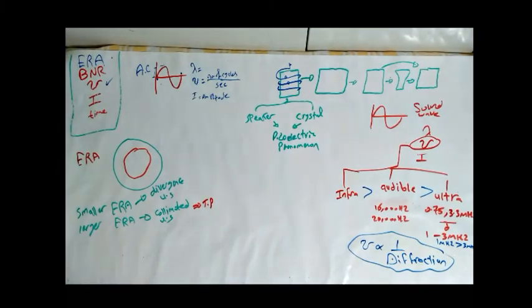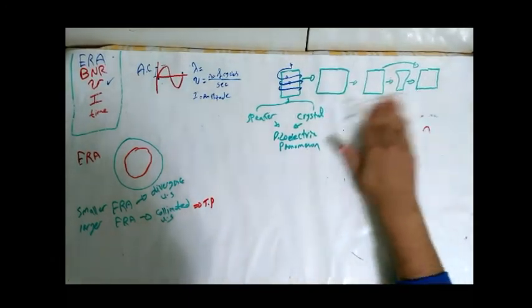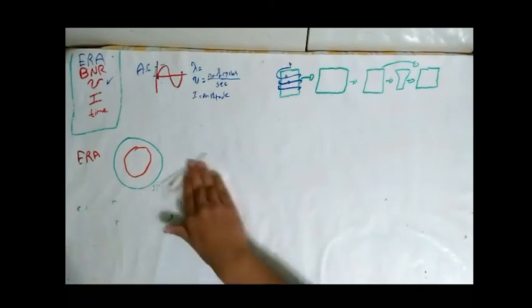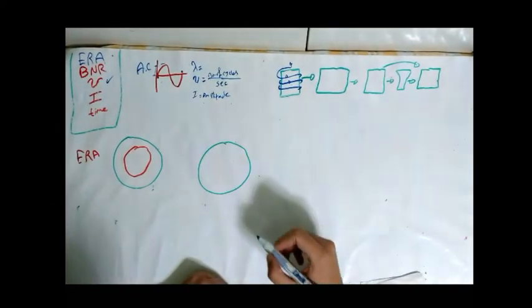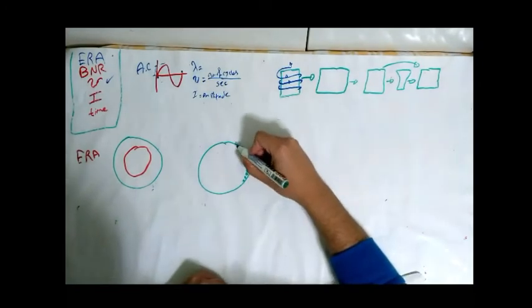Finally, let's talk now about how the sound ultrasound is propagated through the media. If I'm taking a cross-sectional area of the crystal or the speaker and looking from above, I will see the crystal like this, and particles at the microscopic level.